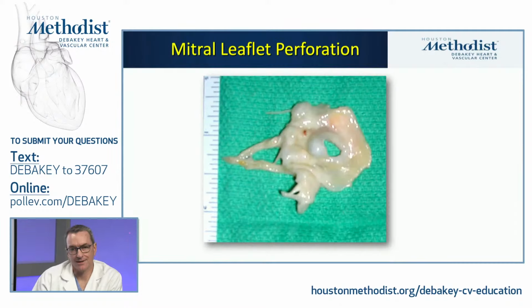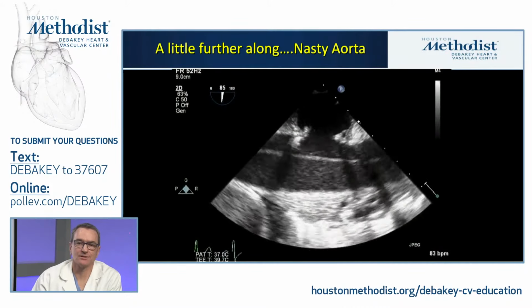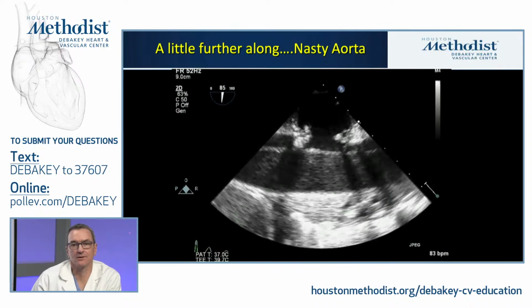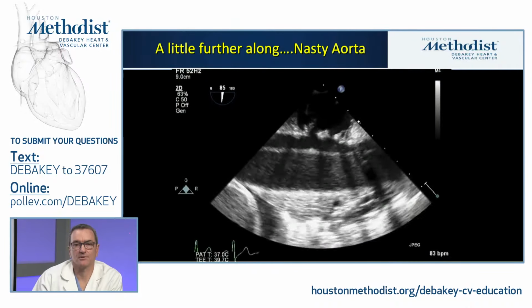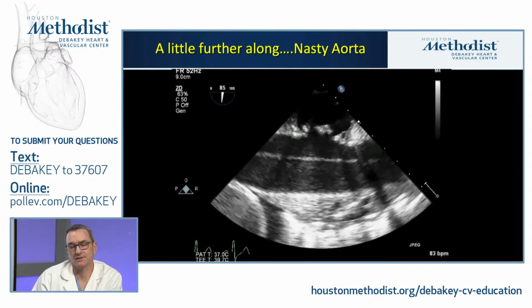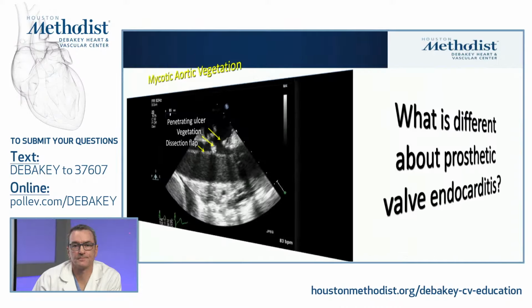And this is what an anterior leaflet, when it's excised, looks like, with a large central perforation. And this is that same patient, a fairly dramatic view from TEE of the descending thoracic aorta with several pathologies all at once as end stage complications of endocarditis. This is a dissection flap, a vegetation, and a penetrating ulcer. So this patient had a very, very poor prognosis.